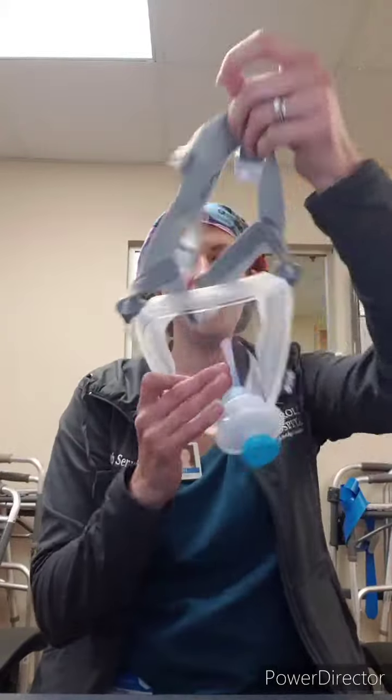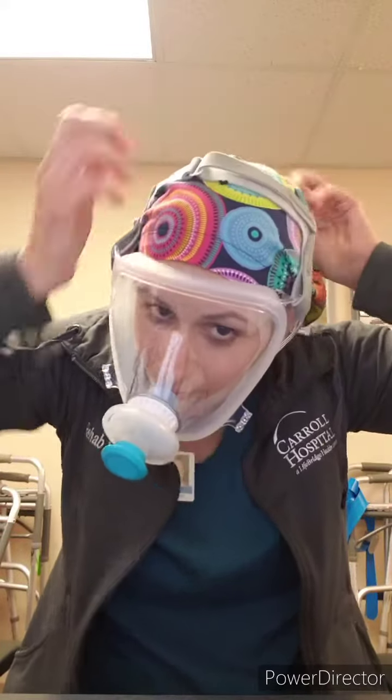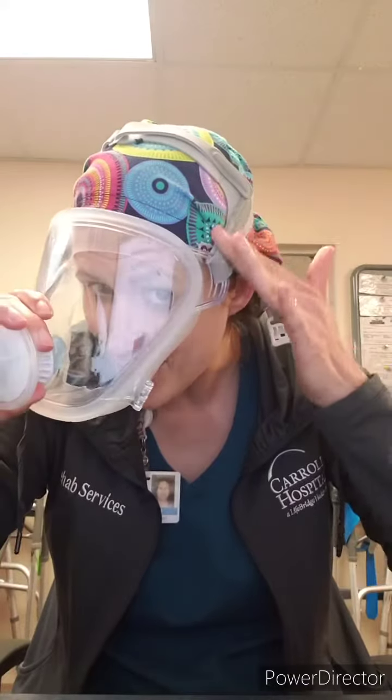Welcome to part two of your Respironics FitLife Total Mask Fitting Instruction. Apply your mask with the top above your eyebrows. The top is adjustable and stylish, as well as the sides are also adjustable. Make sure it is snugly placed against your face.